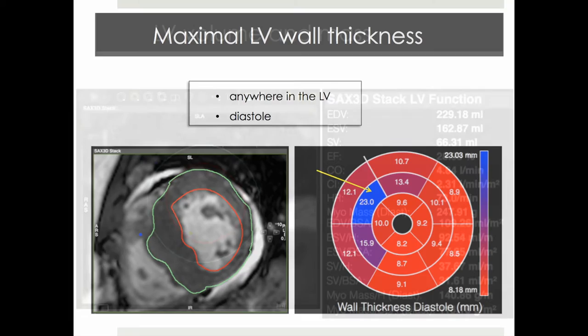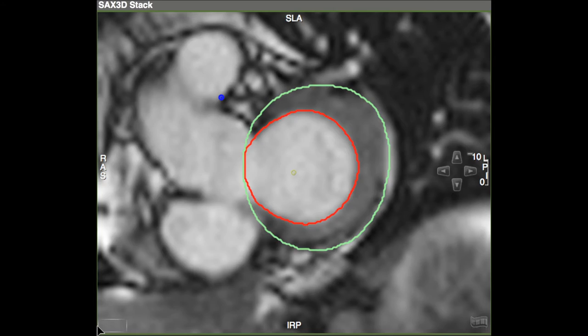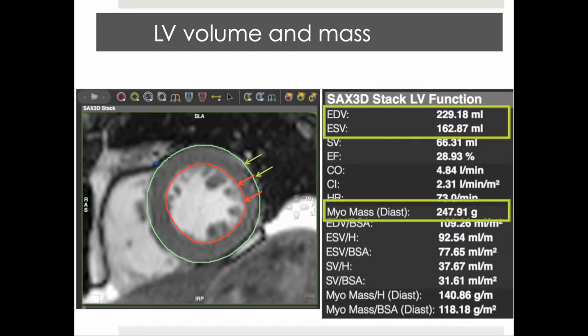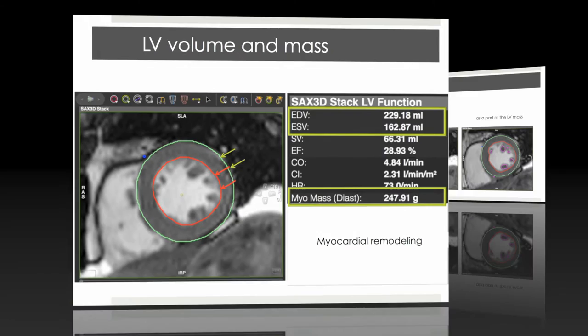And lastly, the measurement of LV volume and mass, which is performed by epicardial and endocardial contouring using a complete short axis stack. The resulting measurements include end-diastolic volume, end-systolic volume, as well as diastolic LV mass. These measurements also reflect the state of concomitant myocardial remodeling.